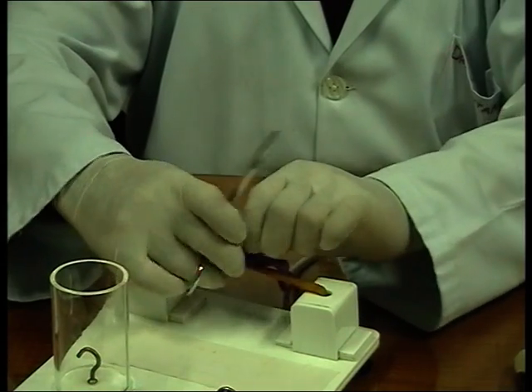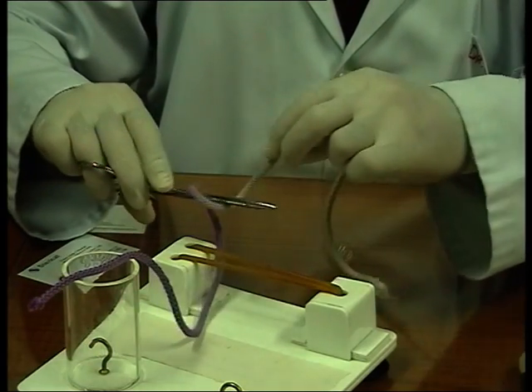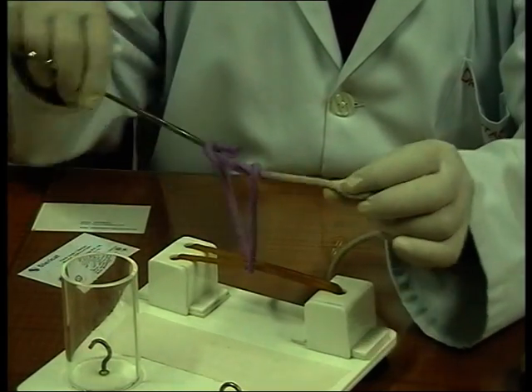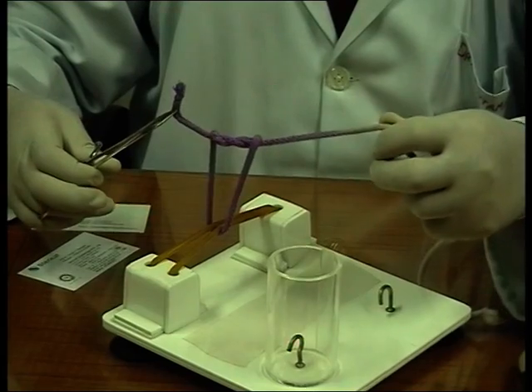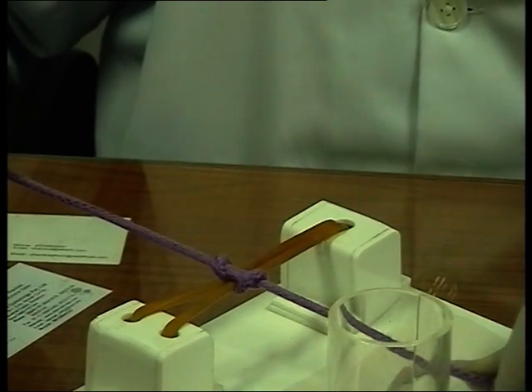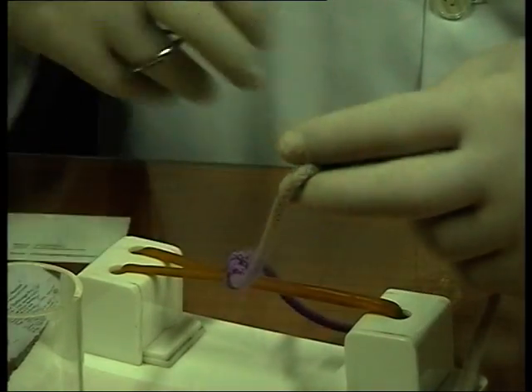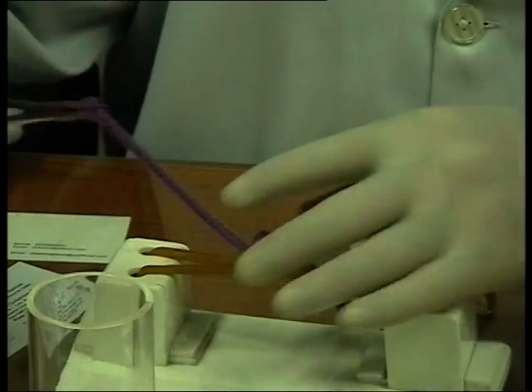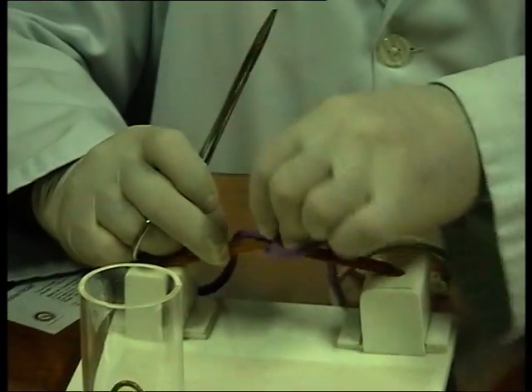Similarly, to put a surgeon's knot, that's a V. I'll take two throws, one, then two. Like I did with my hand also. I took two throws through the same loop. Now, as I do that, you can actually see the same two pulleys again. You can see them now. One here, one here. These two pulleys take the throw down. And I've crossed. Very, very important. Now again, that's the V. I take a single throw and cross back. That's a surgeon's knot. The surgeon's knot with the instrument is no different from the surgeon's knot with the hand, provided you remember that you stay within the V.